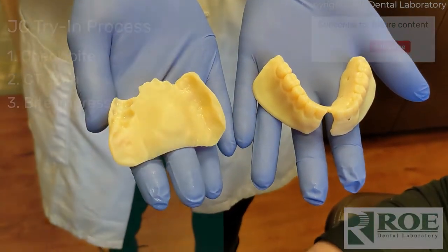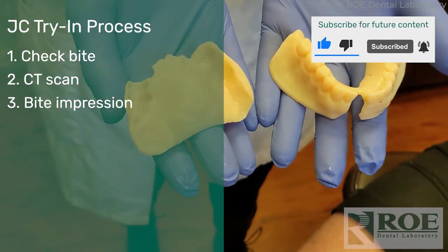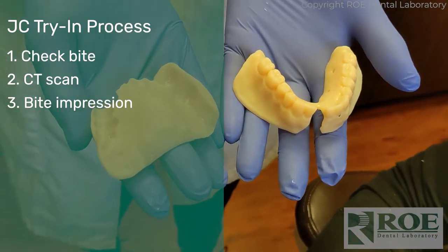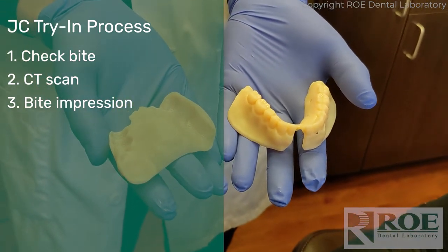Today we are going to try in a couple of scan appliances. We're going to try in the upper and the lower separately to make sure that they fit with no wobble, that they have a nice positive seat. Then we'll put both in and check the bite, and then we'll take a CT scan. So let's try in the upper first.